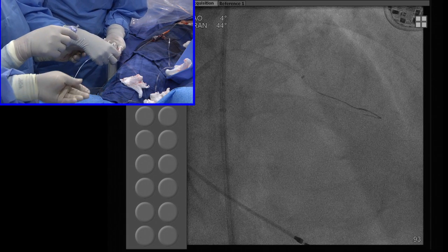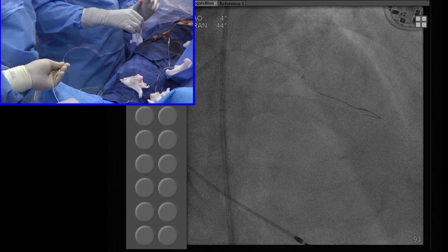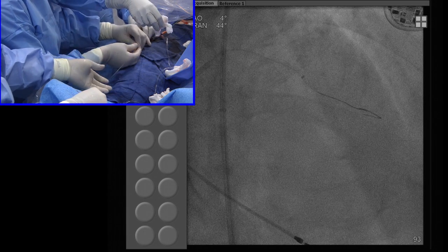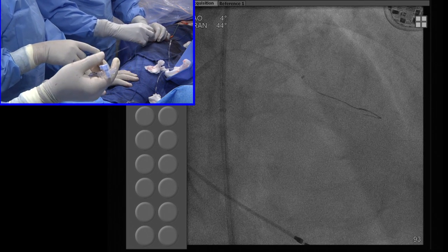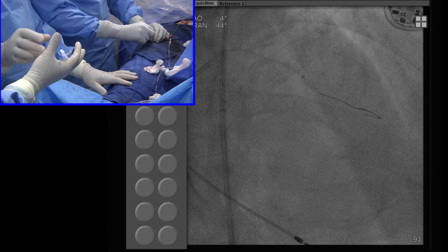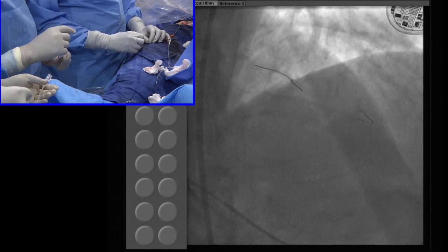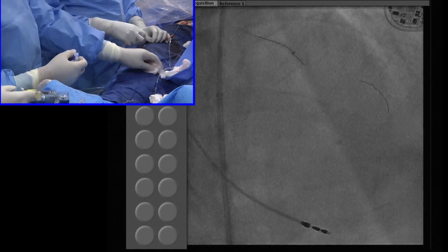So we have dilated now. I think we go in with the Fielder wire, because with this angle tortuosity you need a Fielder to make that turn. Okay, one more try. If not, you want to get some longer balloon, high pressure. 2.5 by 20, high pressure, for a smoother expansion. Change the stent. No, okay, which wire has come out? Maybe the Runthrough has come out, that's fine. No, no, not the Runthrough, I think. Leave it there for now. Good. Don't do anything. Okay. Let's place the stent and then hopefully.